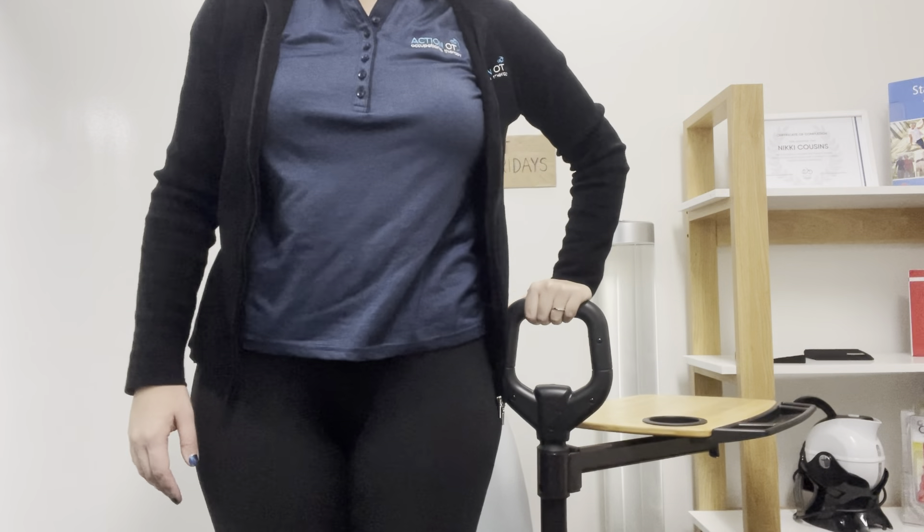So what this is designed for — as you can see, I'm sitting here in an armless chair where I don't have arms to be able to push up from to get in and out of the chair. This one actually comes with a support handle where I've just set it up right near the side at the front of the chair, so I can actually use that as a handle to assist myself to sit down and to stand up from the chair.